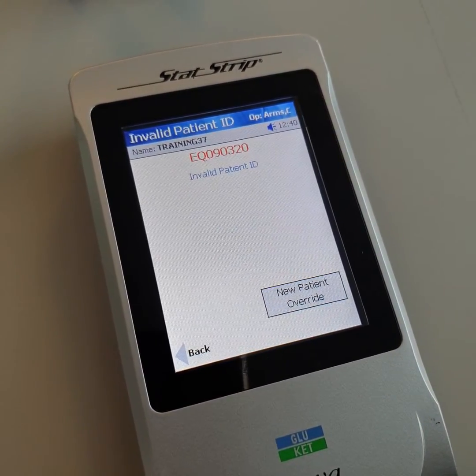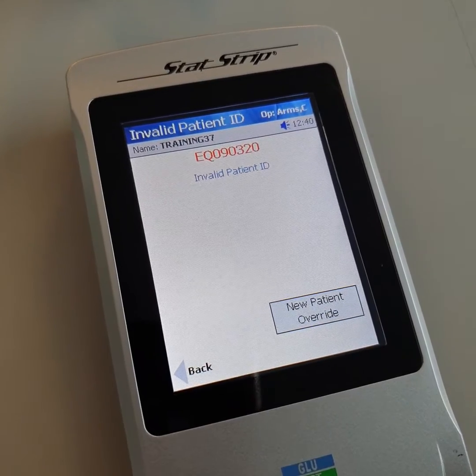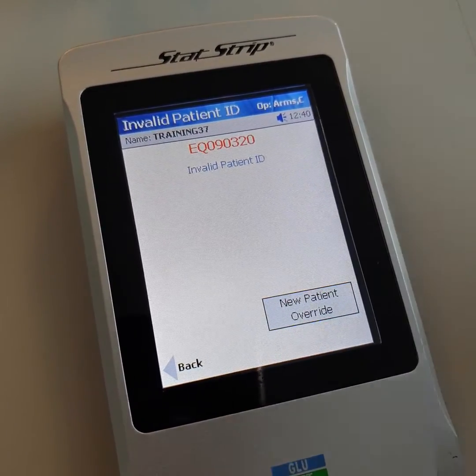Click accept. If the invalid patient ID message appears, please click new patient override.